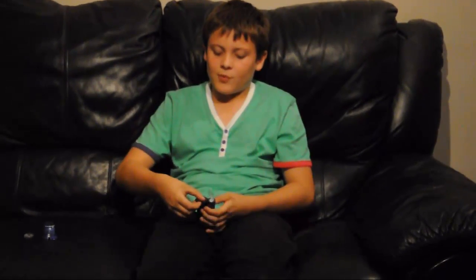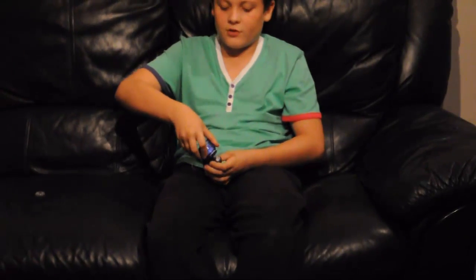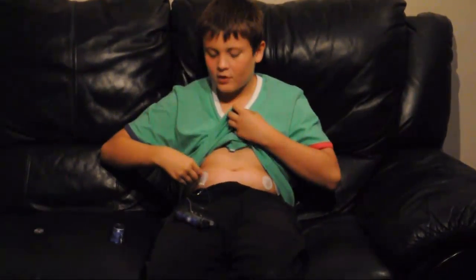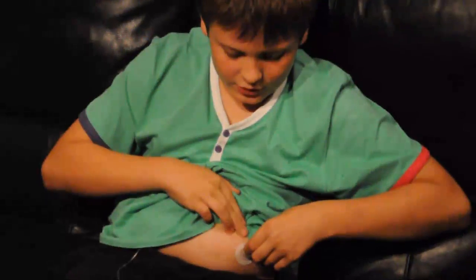I just need to put my clip back on, so you just slide that back on, put the infusion set in again and twist, and then it's locked, and now I'm good to go. It's all put in. Now I have to remove the previous cannula site which I had before. So what you do is, this one already started coming off, which is kind of lucky but kind of bad. You just grab it by the end and then you just ever so gently pull and it'll come out.